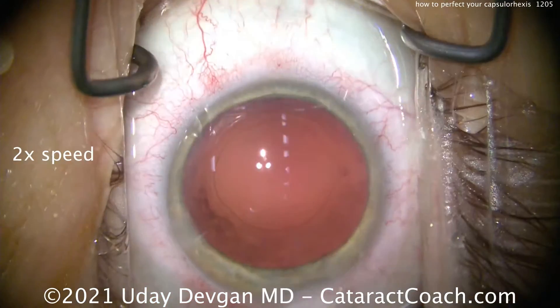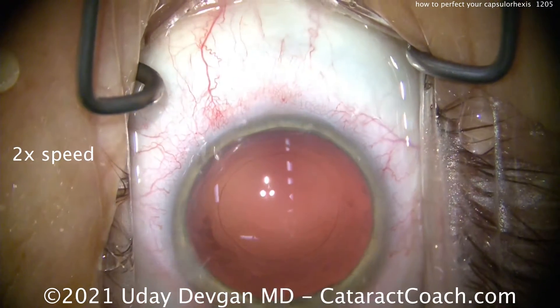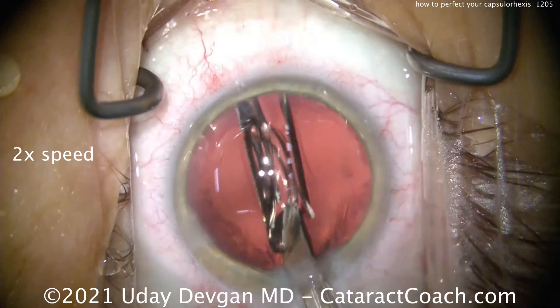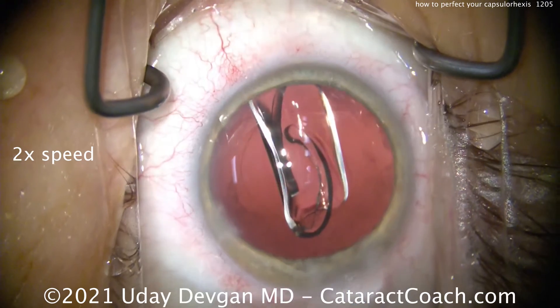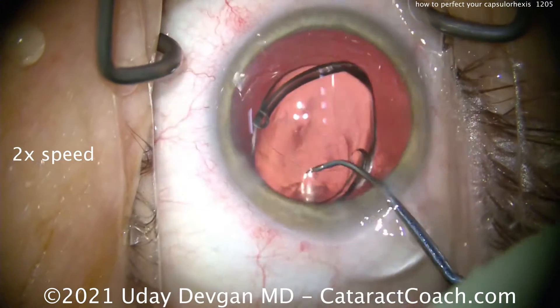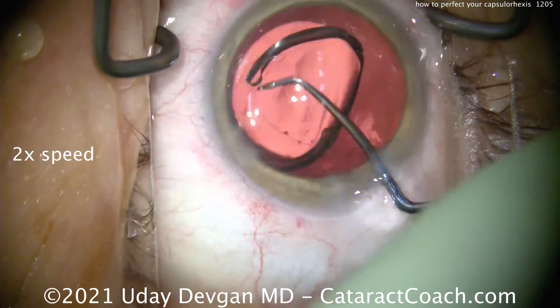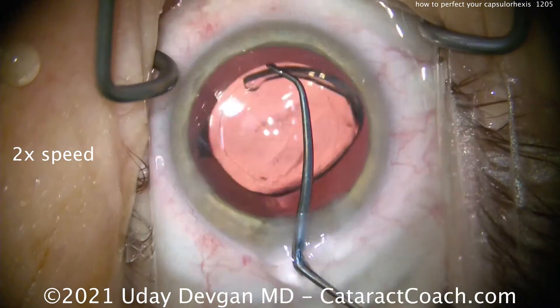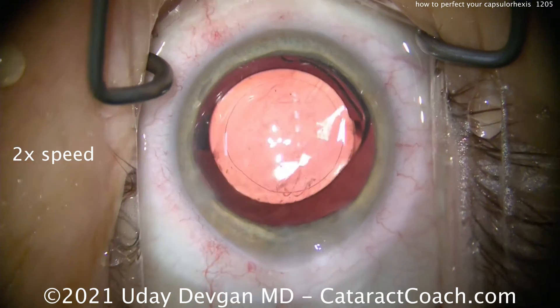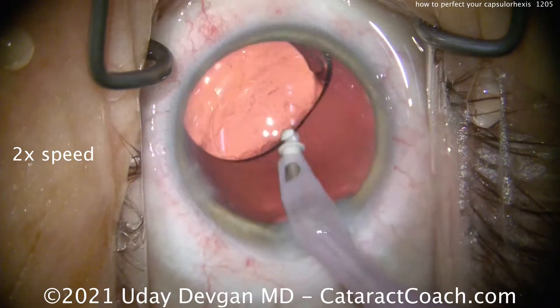That's better. Big difference there. Here at the end of the case I just want to show you putting the IOL in the capsular bag, and to show you what the eventual size of the capsular rexis is. This lens has a 6mm optic so you'll easily be able to judge the size of the capsular rexis. Of course we want to have that capsular rexis overlapping the optic for 360 degrees, and look at that — that's a nice looking rexis.